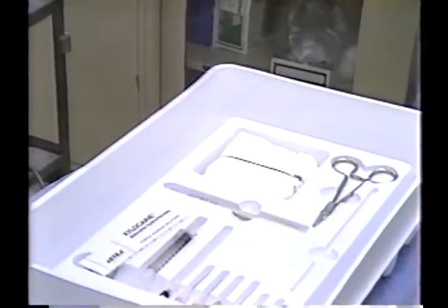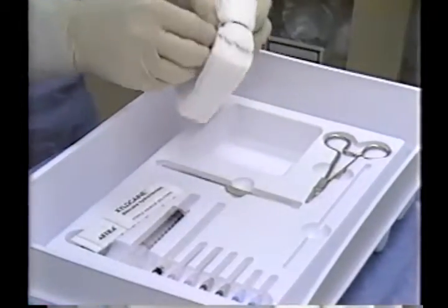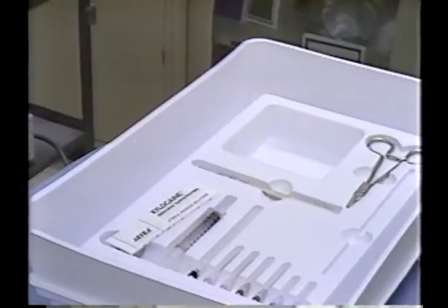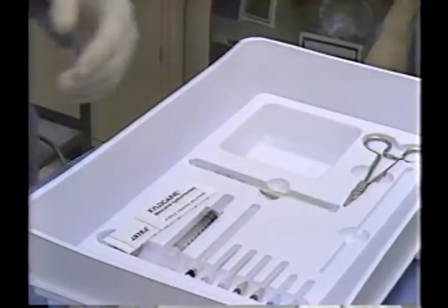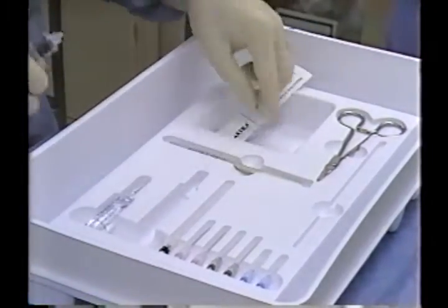Secondary packaging material is removed from the top tray, which contains 10 4x4 radiopaque sponges, a 10 milliliter vial of 2% lidocaine without epinephrine, a 10 cc syringe and various size needles, scalpel with a number 11 blade, and a hemostat.